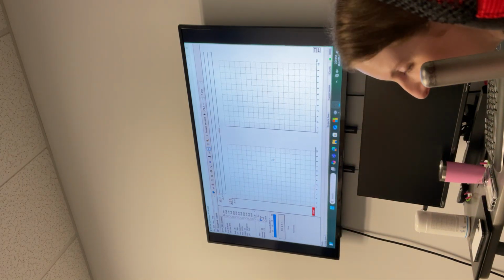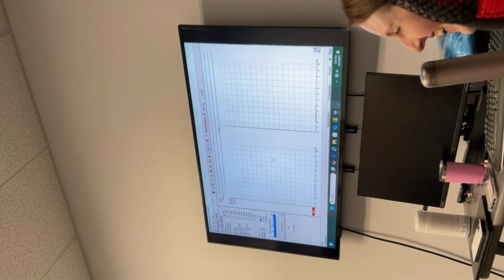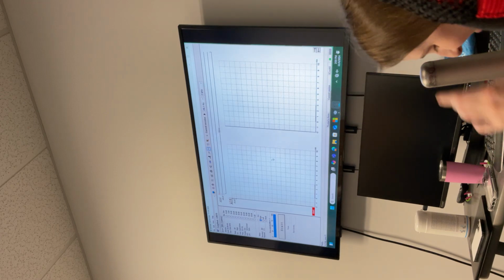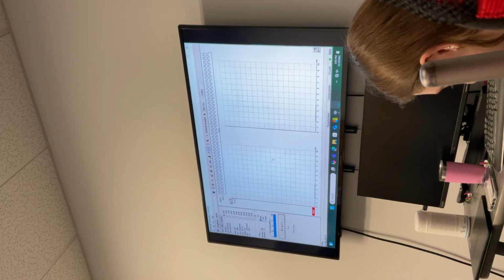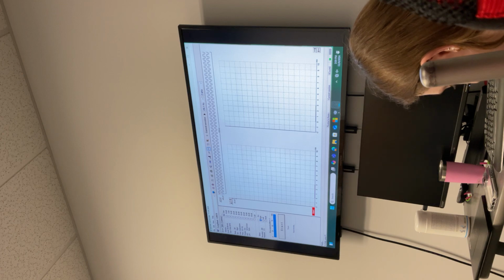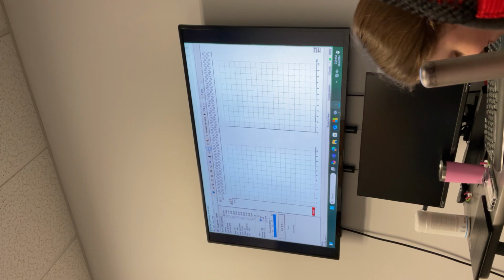Was she already scrubbing? Yes. Place their electrodes. I thought she was going to put a swab in my nose. Okay, we place electrodes and we'll do it. So we'll take this out. It's already on there. Yeah, it looks weird. Like on my phone it looks fine, but it's right along the bottom. Did you hook this on him? Some of it's missing out. I don't like that. That annoys me.